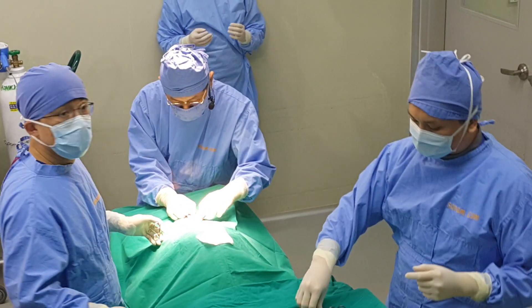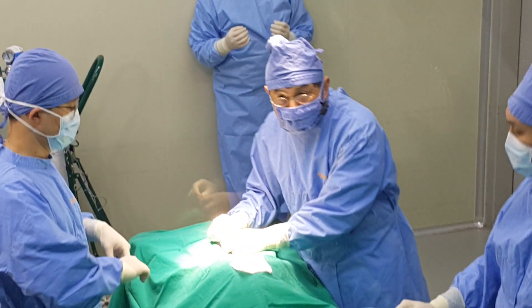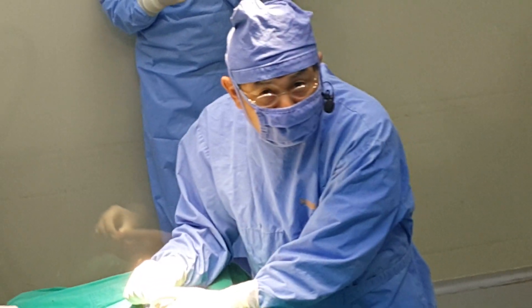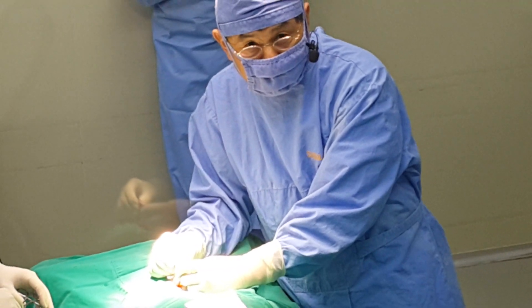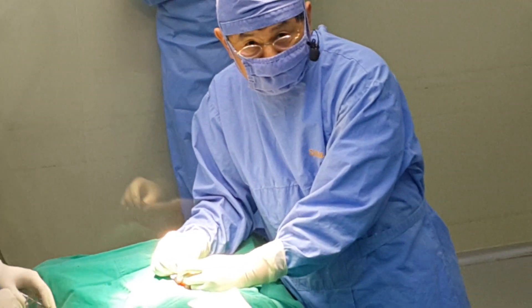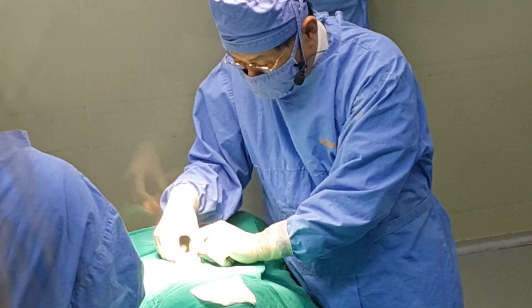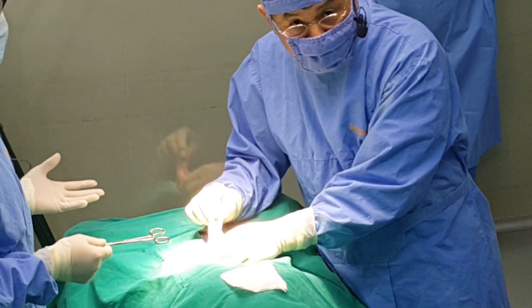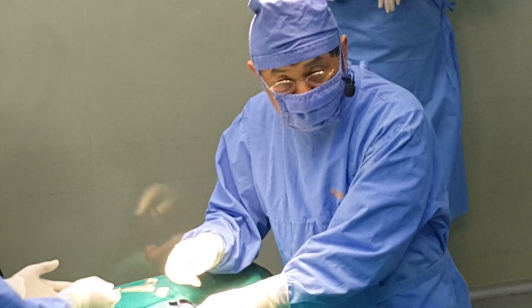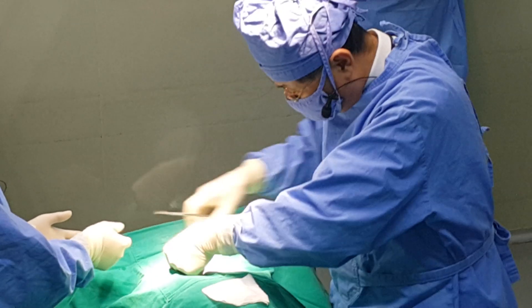The two fellows working with him are the Brazilian doctors, the PhDs. This is Philip on the left side. You can see the ovary here, and we are going to transfer to the left side ovary.